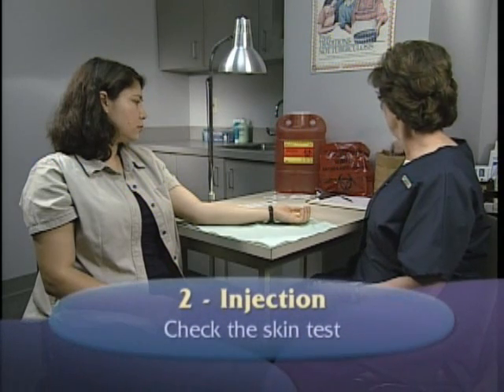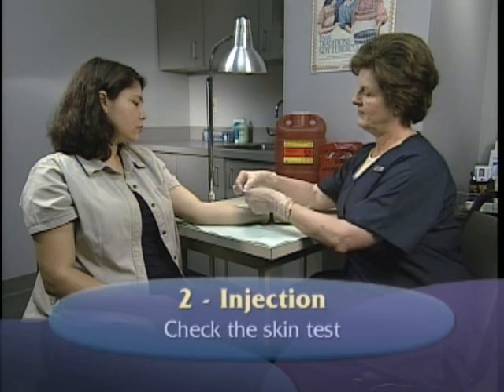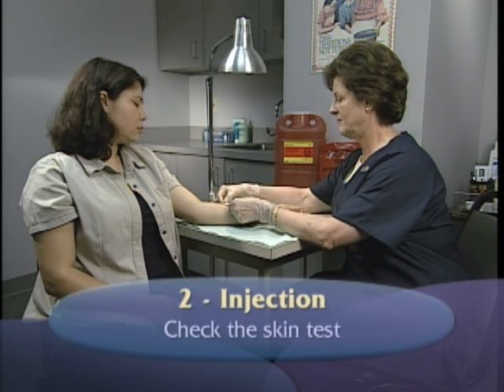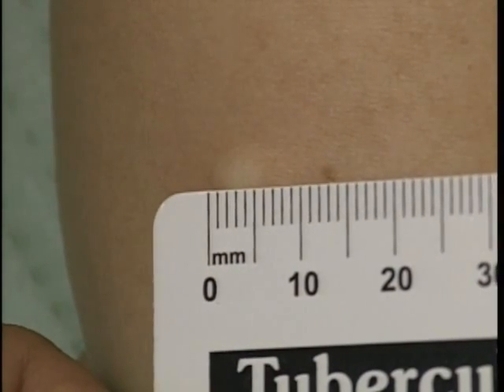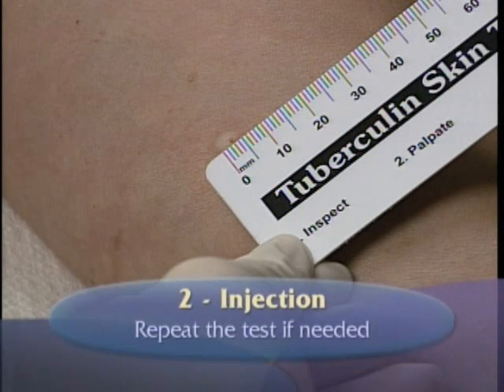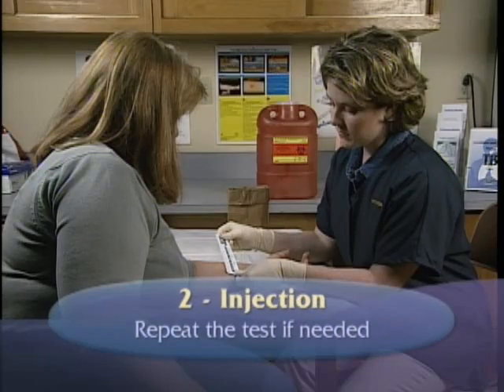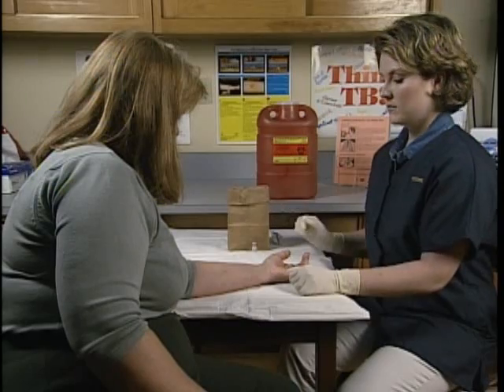To determine if the skin test was administered properly, use the millimeter ruler to immediately measure the wheal at its maximum size. The wheal should be at least 6 millimeters in diameter. If the wheal is less than 6 millimeters in diameter, then the test should be administered again. The needle bevel may have been inserted too deeply or an inadequate dose administered.